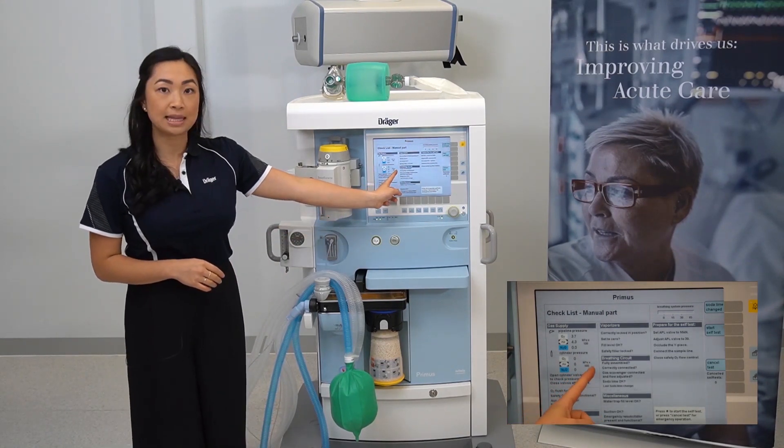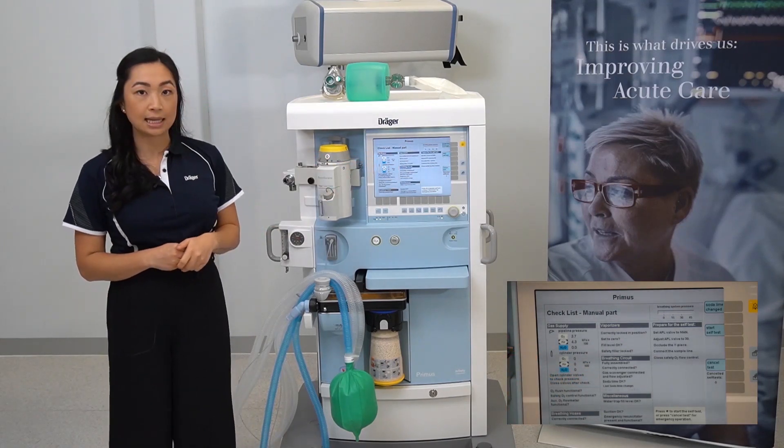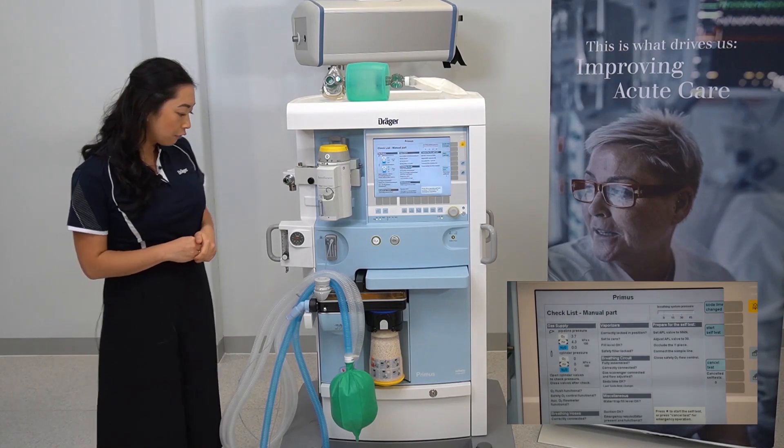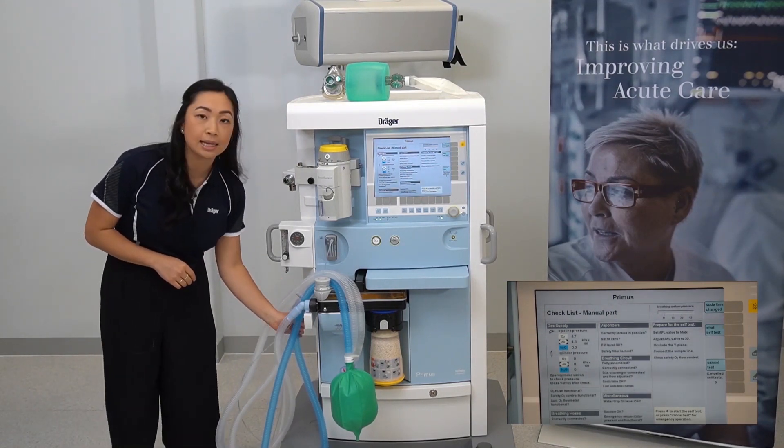We are now at the breathing circuit. Check that it's fully assembled and correctly connected, and verify that your hose connections to the ports of your breathing block are tightly on.